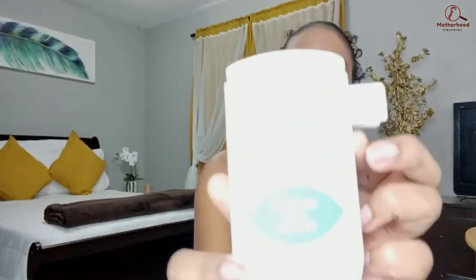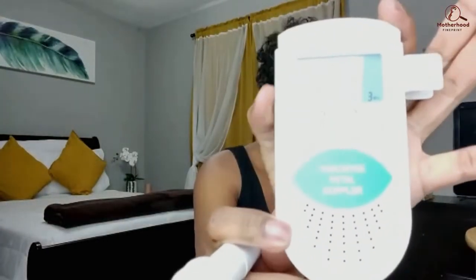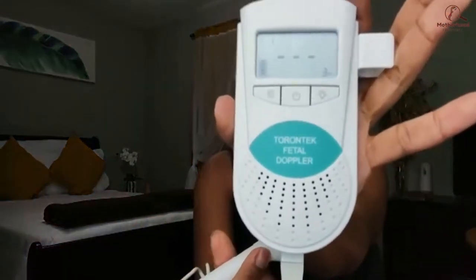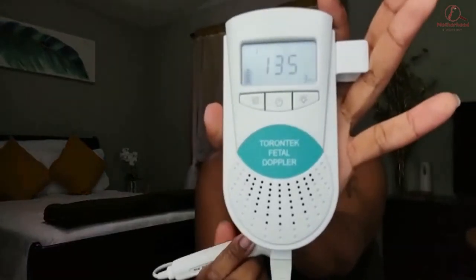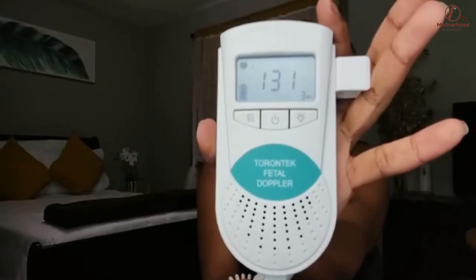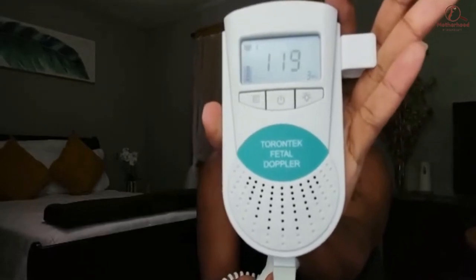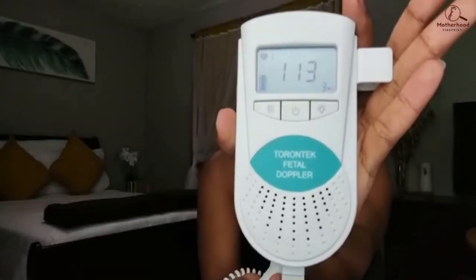Right now the volume is at zero — I turned it all the way down — and now we're going to turn it all the way up. You can already hear it, and that's what it sounds like. You can see that little heart showing up in the corner. Once you're reading your baby's heartbeat it will stay. That's just how loud it gets — it gets pretty loud.